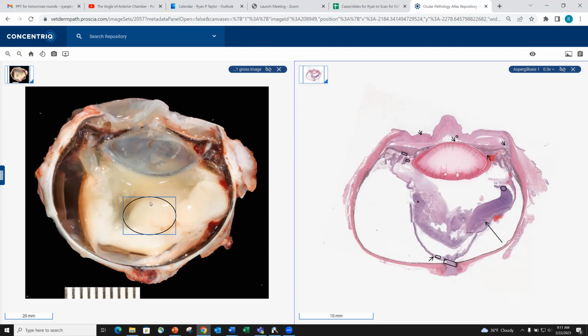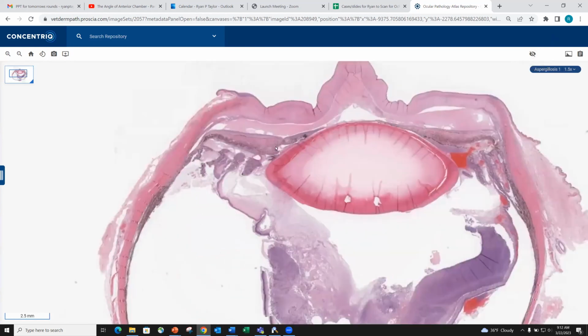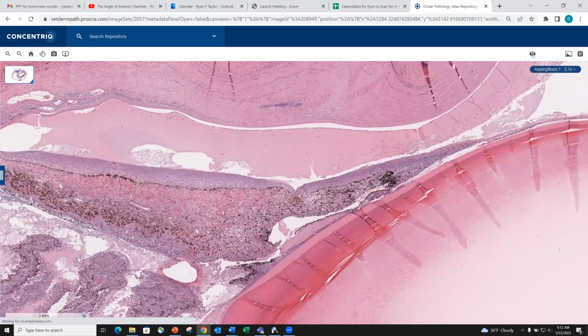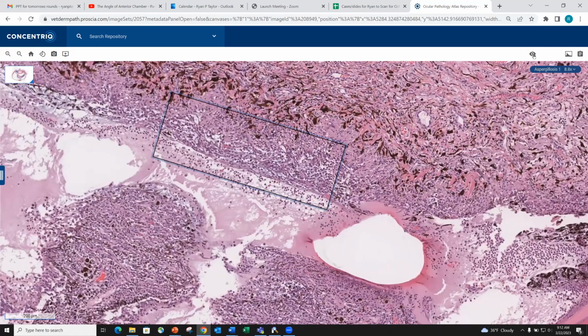When you're ready to get rid of one of the additional viewers, what you will do is just click on this small little X associated with the one that you want to get rid of. So once you click on it, it goes away. The annotations, you can toggle back and forth. So if you want to work through the slide by yourself at first, you just click on that eye, all the annotations go away. They will not appear again until you tell them to reappear. So once you push on it again, the boxes will reappear with what we are trying to highlight.